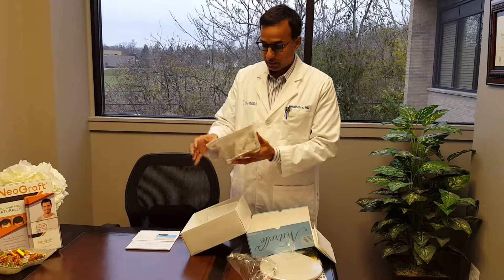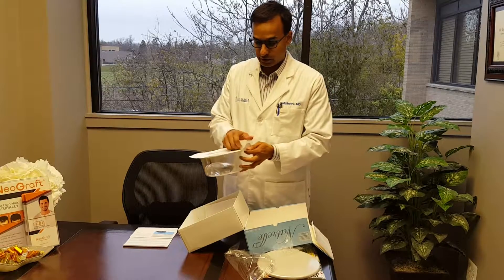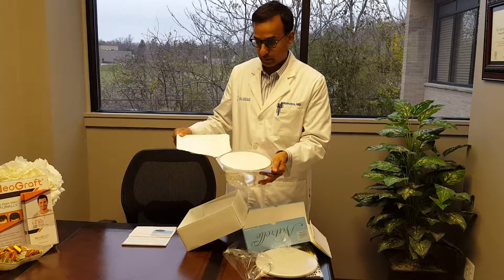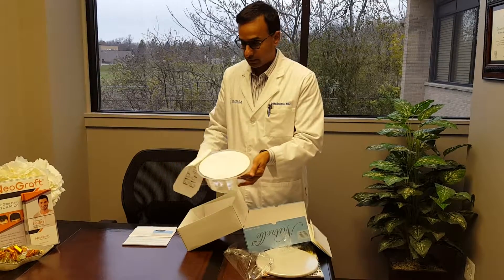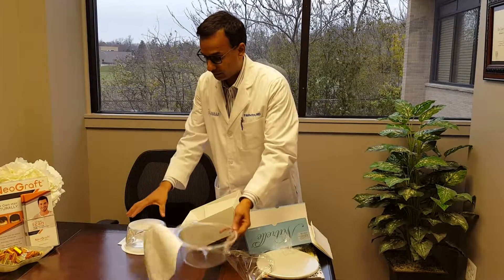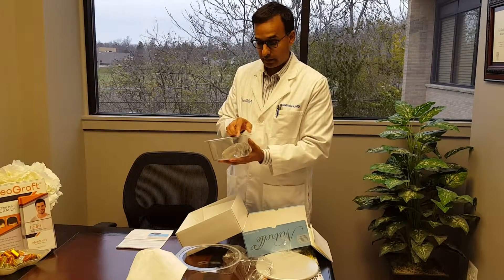So this is how an implant comes. It's wrapped inside, and during surgery everything has to be done sterilely. We open this part up — it's packaged once, and then it's actually flipped onto the surgical table. The assistant never actually touches the implant.